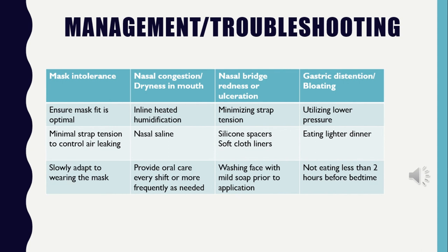Another important thing that also goes with ulceration prevention, the nasal bridge or redness, we want to minimize any strap tension again, and don't put it too tight to where it's going to create any pressure. Use the silicone spacers or soft cloth liners, and also wash their face, intermittently removing the mask to moisten their face, dry their face, and prior to the application of the mask again.